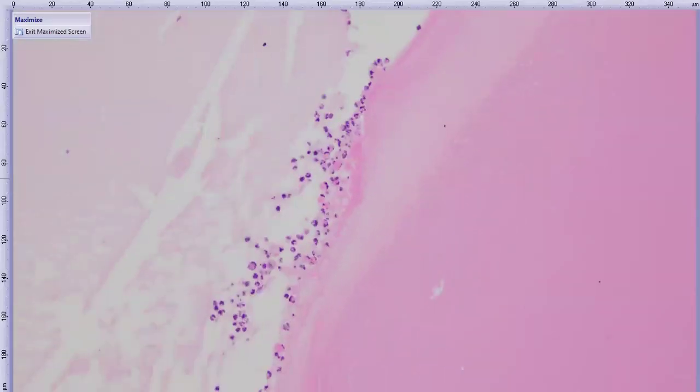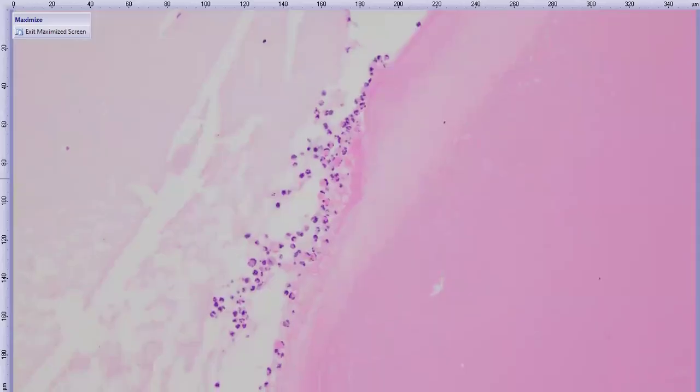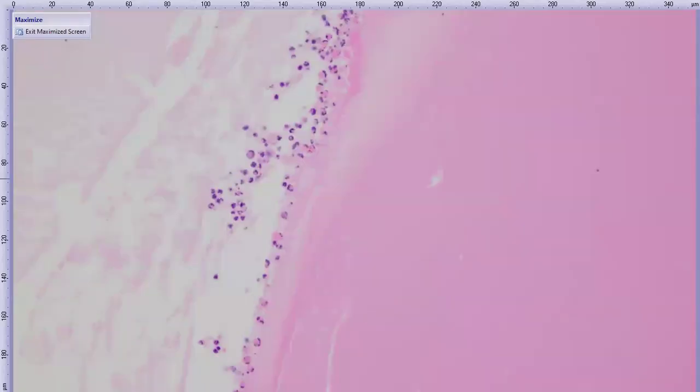Brakel asks, okay, never mind. Go ahead. Oh, you answered it. Oh, I did? She asked if any of that could have been lens capsule itself. So I think could be. Where Megan first started was more posterior lens capsule, which should have been much thinner there than it was. So I suspect that some of that at least is not just lens capsule, but yeah, like this here, I would imagine that this is more likely leaked protein from here to here, and because we kind of have a distinct capsule from that.